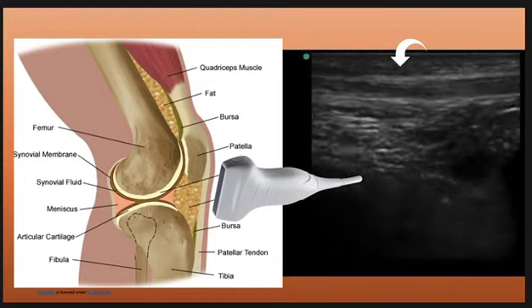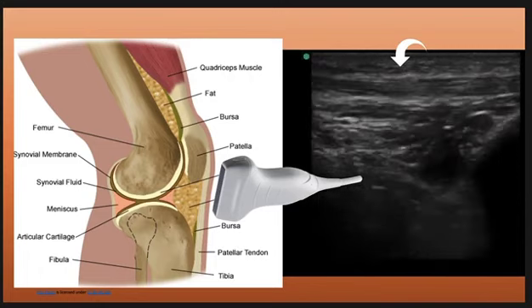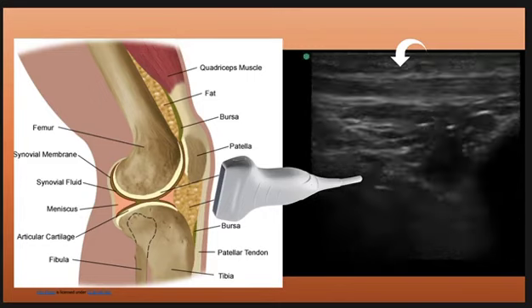And now to round out the rest of the knee views, here's a look at the patellar tendon. There's a normal clip here. You can see the insertion of the lower part of the patella and follow it down into the tibia.